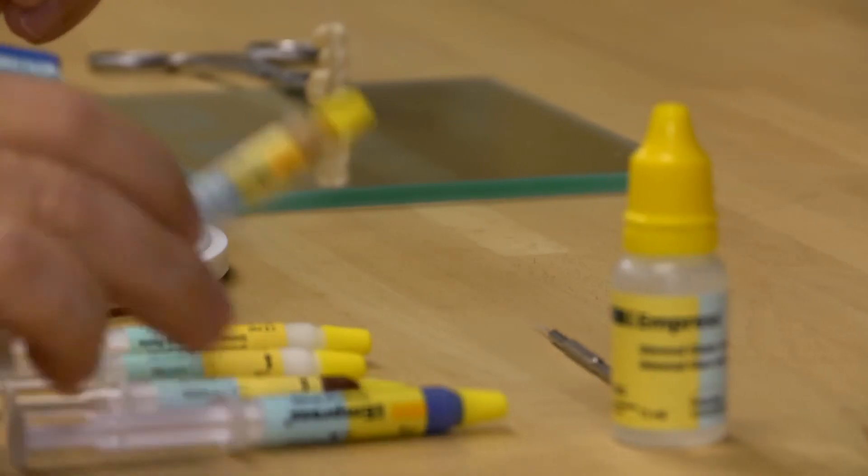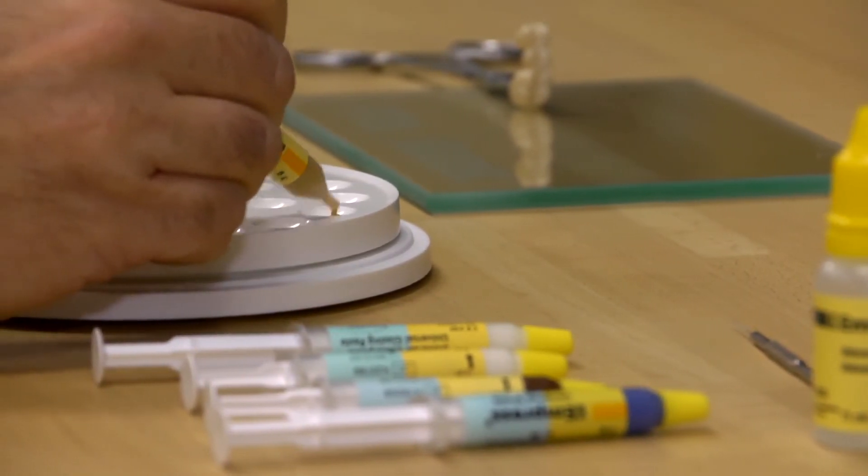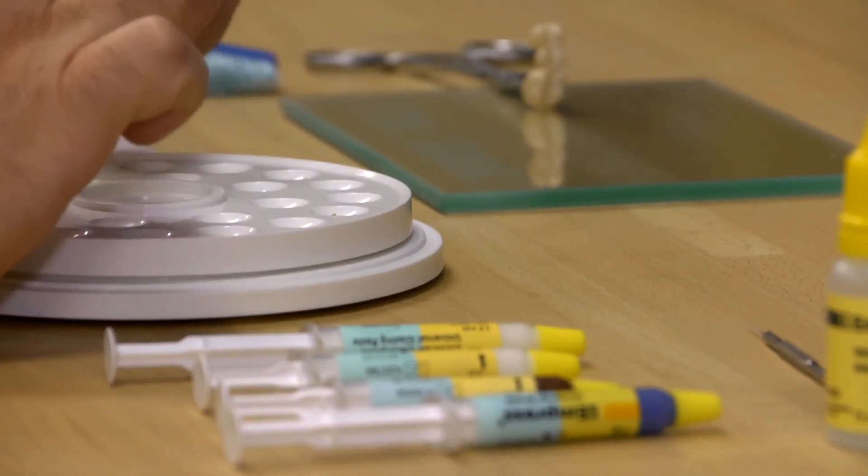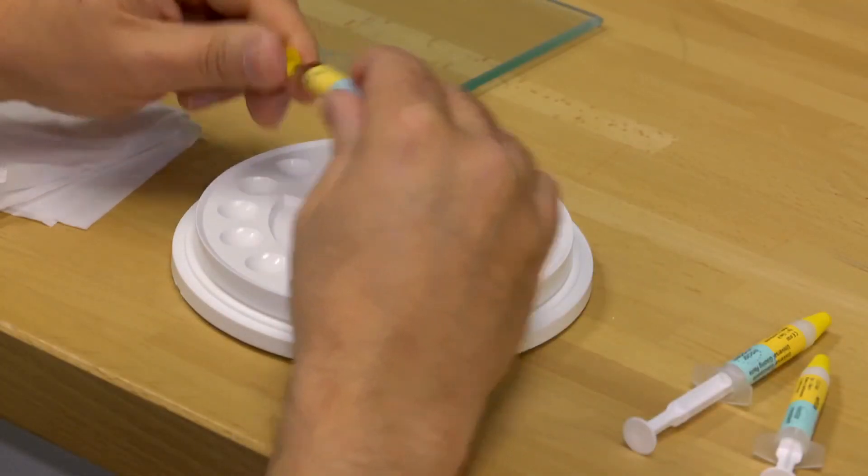Staining technique for restorations made with Inchorus TZI is virtually identical to the PFM method. They can be finalized using all standard paint and gloss colors for zirconia ceramics. Observe each manufacturer's processing instructions at all times.